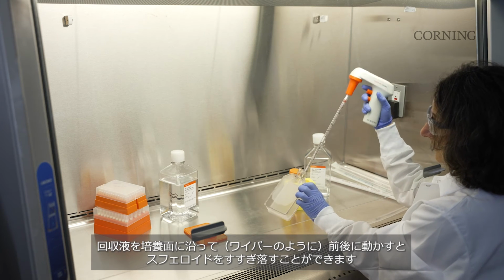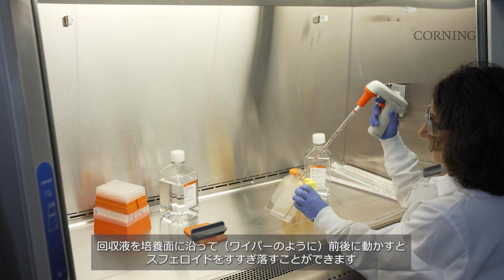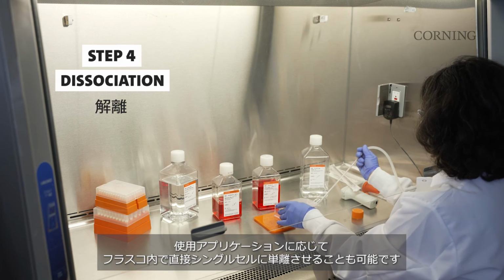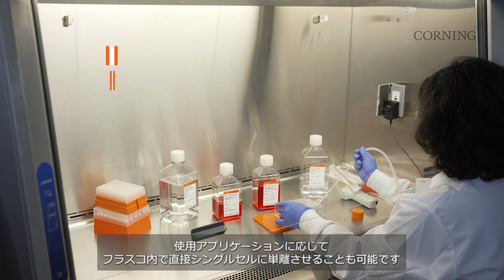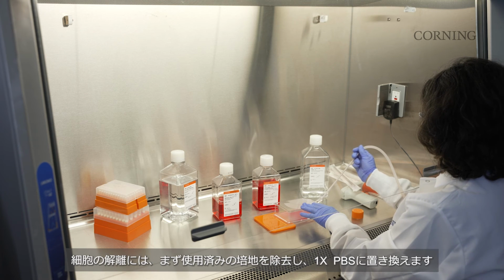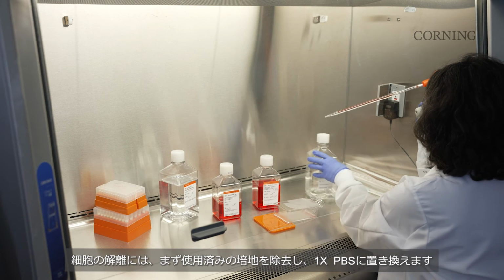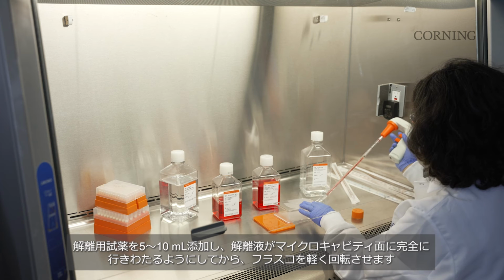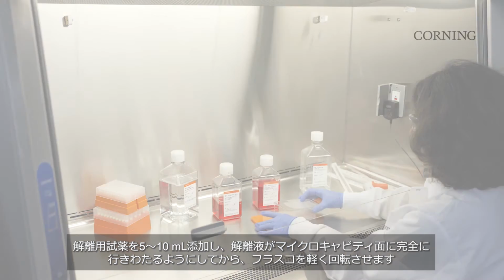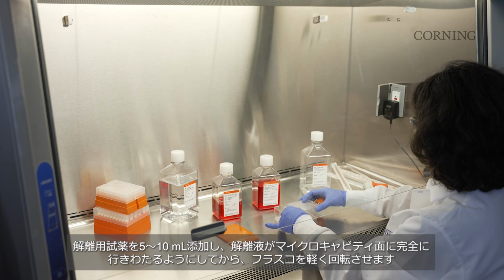A back and forth motion like a windshield wiper against the growth surface is recommended to rinse the spheroids out. Depending on downstream requirements, spheroids can also be dissociated into single cells directly in the vessel. To dissociate the cells, remove spent medium and perform a 1x PBS rinse. Add 5 to 10 milliliters of desired dissociation reagent and allow liquid to fully distribute across the surface, swirling the flask lightly.